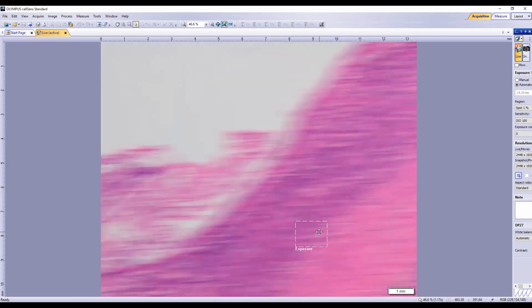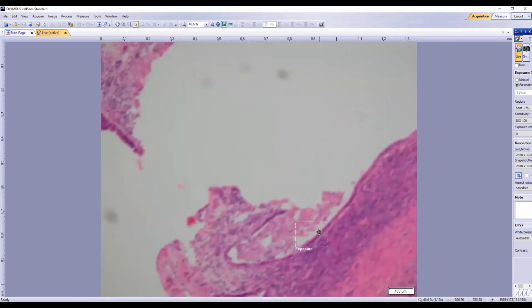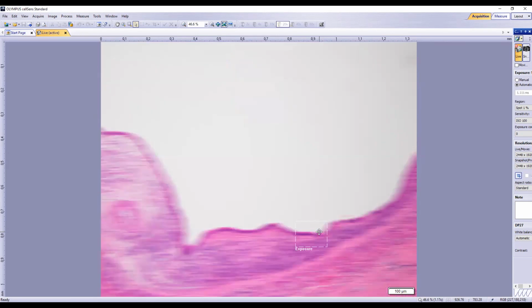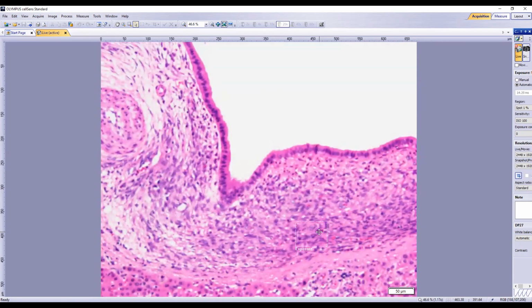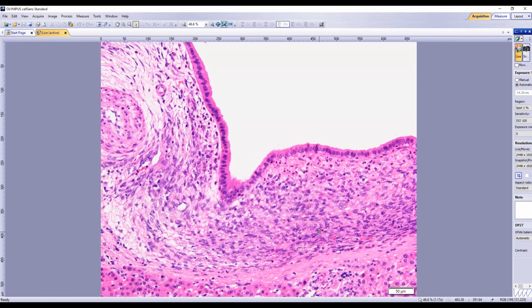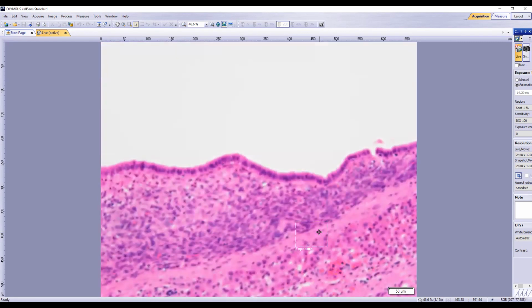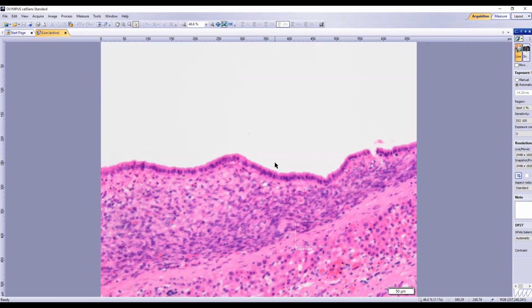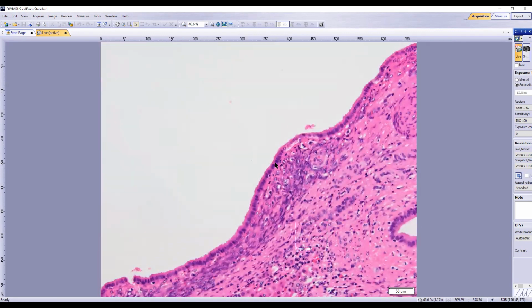But I think these can have a gastric foveolar type of epithelium and some other types of epithelium, right? Well, at least originally, it's a mucinous epithelium, but when these cysts become really enlarged, they're filled with secretions, so the epithelium can become attenuated and lose its mucinous appearance. And so it almost looks like a serous epithelium with no mucin in there. Yeah. And lack of mucin should not dissuade you from making this diagnosis.